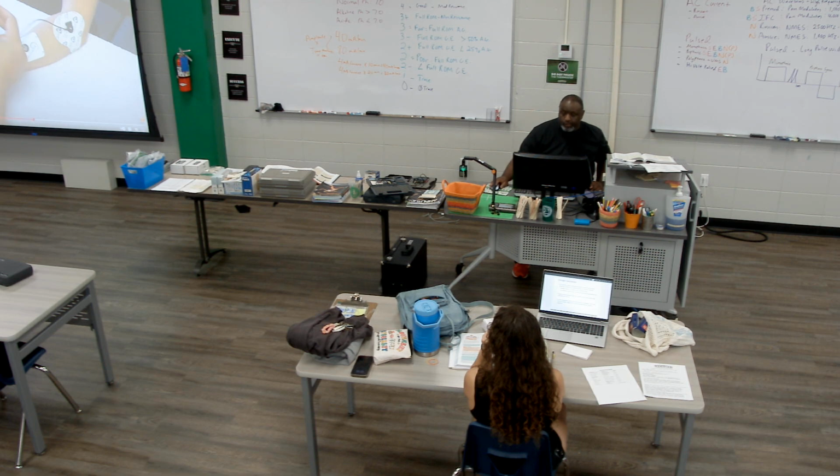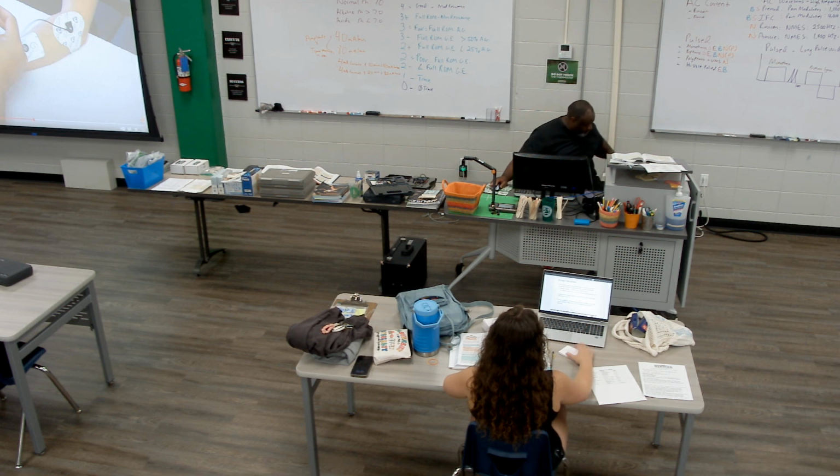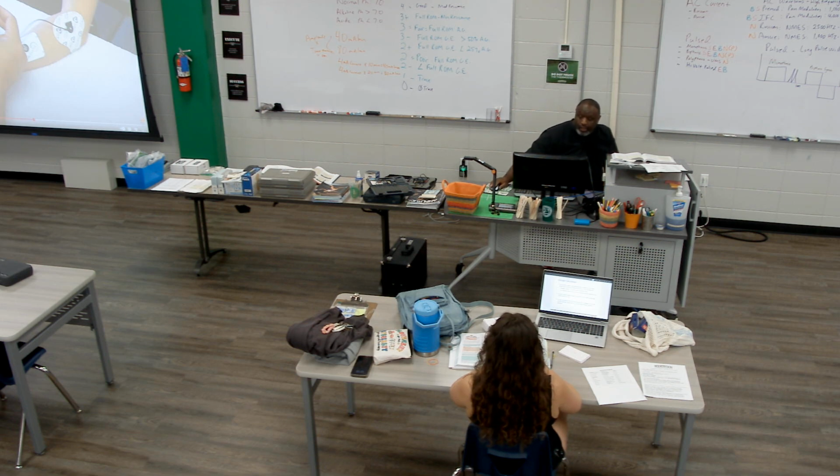Okay, so if they're attaching a black electrode, what did we tell you all the black electrode represents? The black electrode represents the cathode. Very good. Cathodes, are they negative or positive? Negative. Negative, which means the drug underneath here has to be negative. Very good.